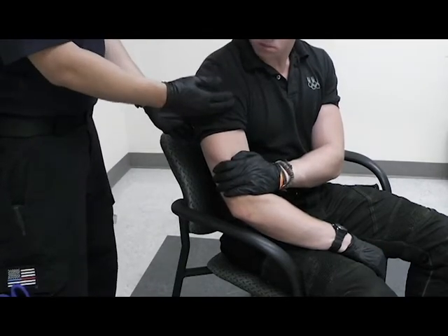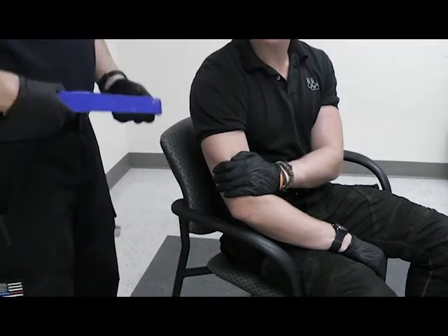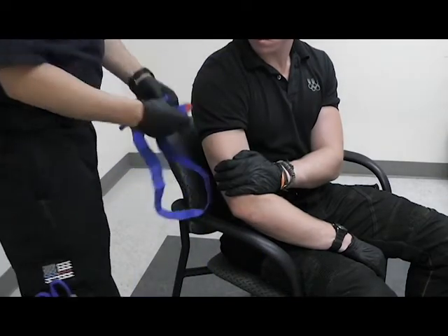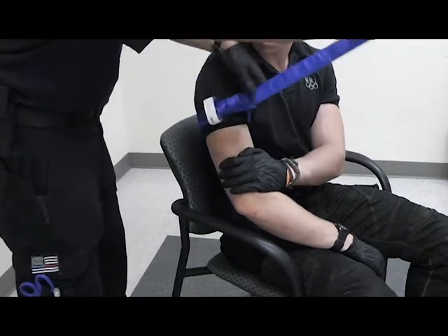I can apply a tourniquet above the injury, closest to the joint, to prevent further blood loss. To apply my tourniquet, I am going to take my tourniquet, place it on the arm, and secure it.